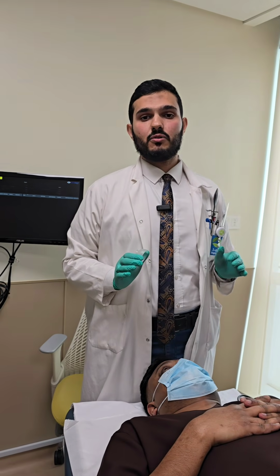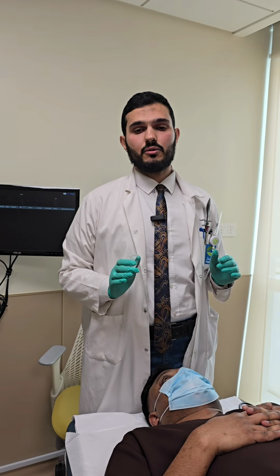This is just a simple demo of the technique of the UBM immersion shell technique.